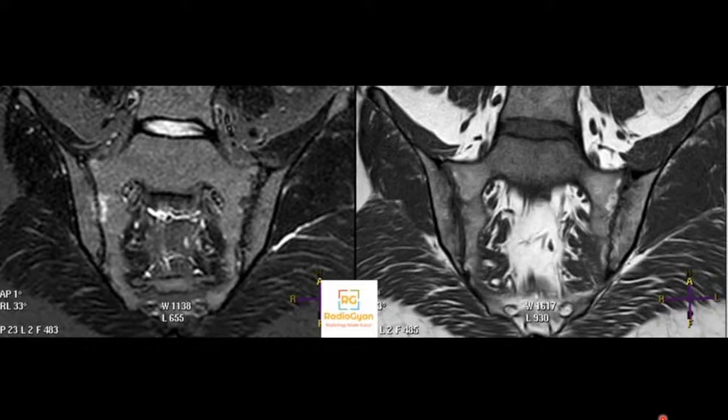Okay, somebody asked me, why is it acute and chronic? Okay, I'll describe. Just for everyone's benefit, I'll go over the imaging sequences. So this image on the left is a STIR sequence. A STIR is where fat is saturated and water or water containing tissue stands out. This is a T1 weighted sequence. The question was, why is it acute and chronic?